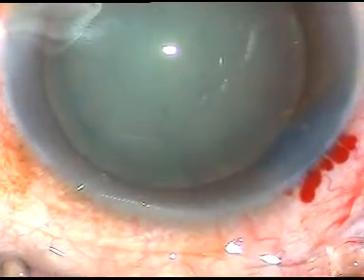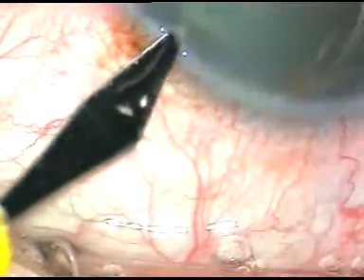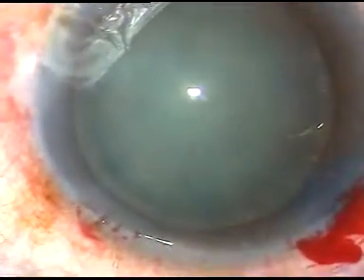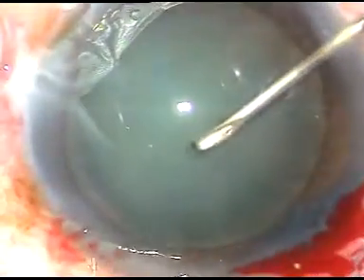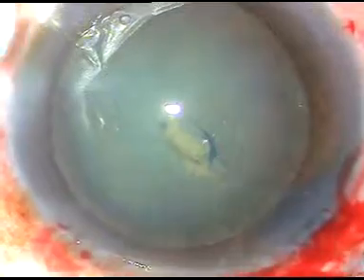This is an unedited video and you are going to see each and every step of the surgery. I have supported the eyeball with a cotton-tipped bud so that I don't cause any subconjunctival hemorrhage. This is how I go into the eye and incise the anterior capsule of the cataract lens.